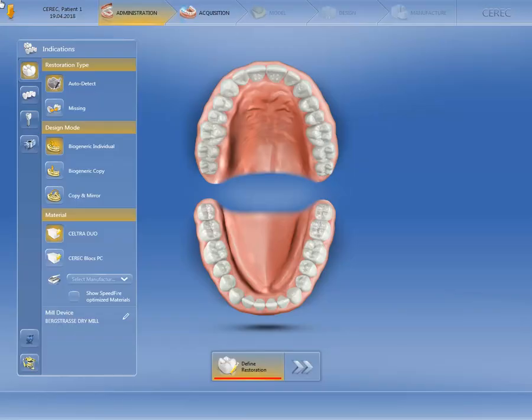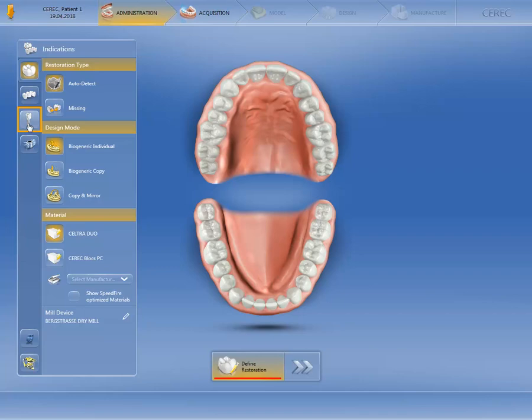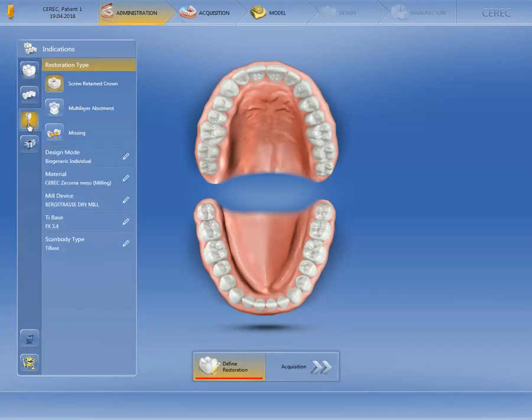First of all, we created a patient case and will now select the indication implant in the administration phase. Then we define the restoration type, the design mode, the material, and the milling and grinding unit, as well as the scan body type.